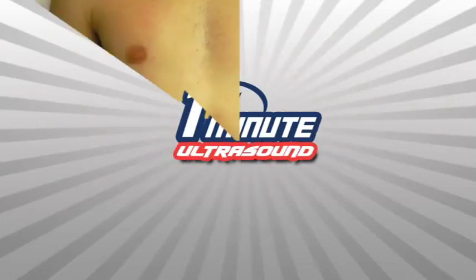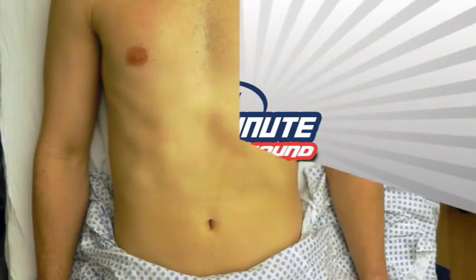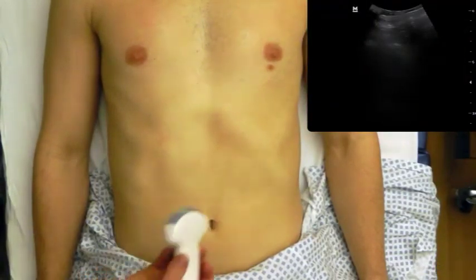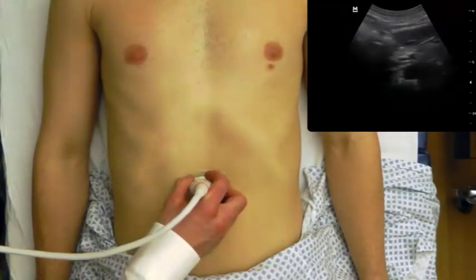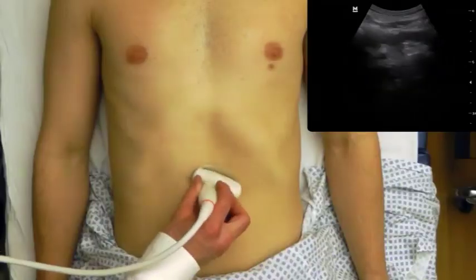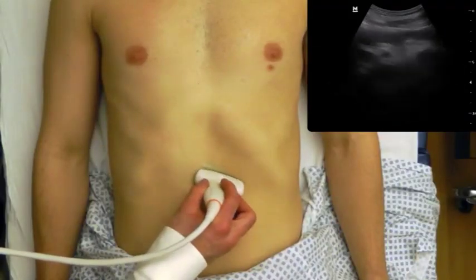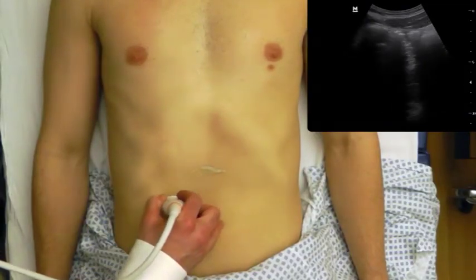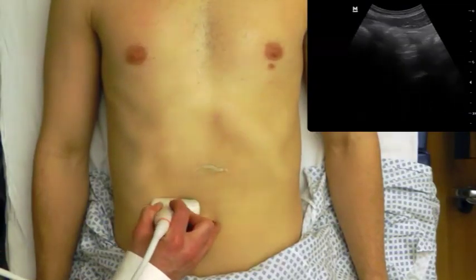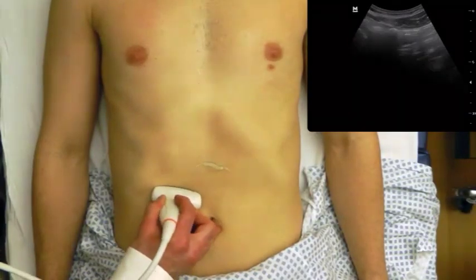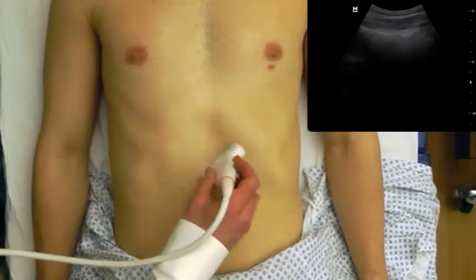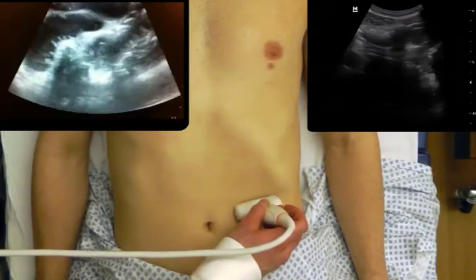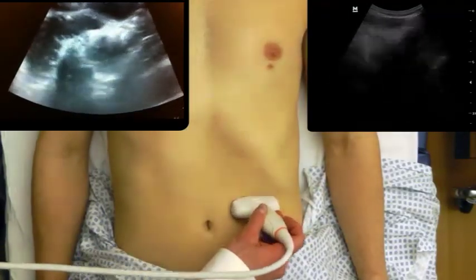In an ultrasound, this is the evaluation of small bowel obstruction. I'm using the curved linear probe and placing the probe on the patient's anterior abdomen, looking for fluid-filled loops of bowel. In small bowel obstruction, we would expect to see small bowel loops that are dilated greater than 2.5 centimeters, and they often have back-and-forth peristalsis, as seen in the left corner of your screen.